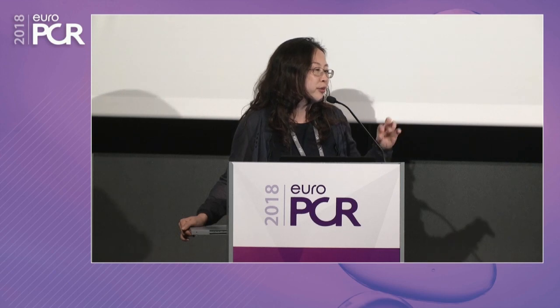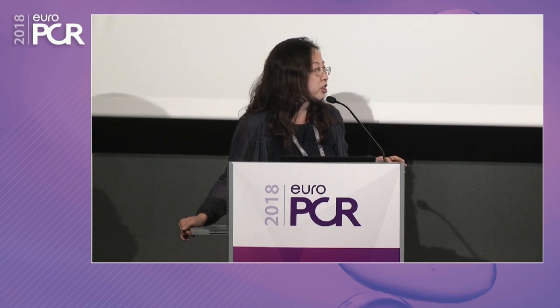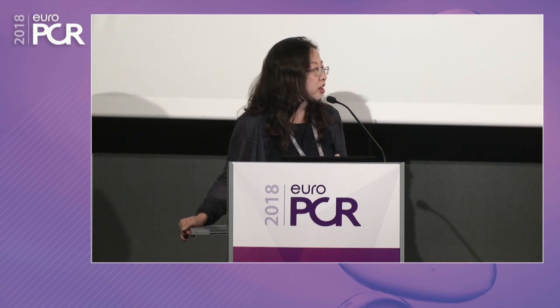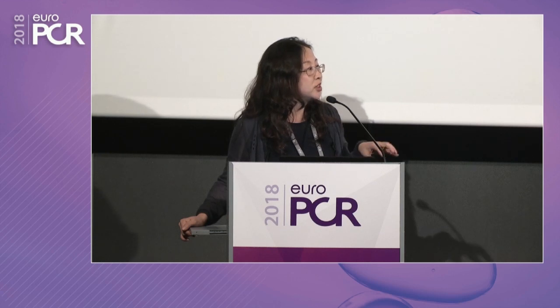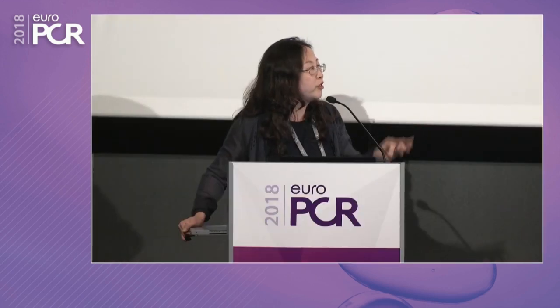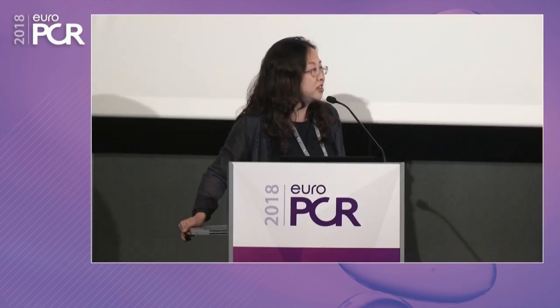I know, according to my experience, if there was no very severe calcification proximally, the balloon can be very easily taken out. But if the patient has very severe calcification, I will not do it that way. There is a technique in which you partially inflate that balloon after deployment of the stent, and then you repeat optimization proximally. But you just pull it to have space and keep the diagonal branch open. Yeah, I just want to keep it open. Yeah. Want to have a bigger space. You did not have the intention to open that balloon. No? Yes. Okay.